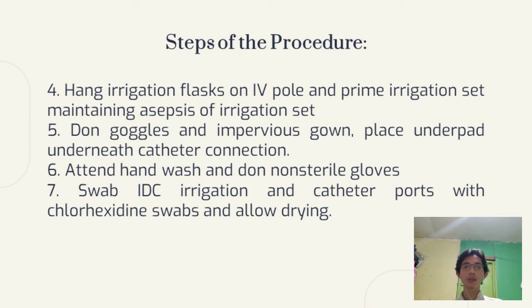So next step is to don goggles and an impervious gown, placed underneath the catheter connection. Next is to attend hand wash and don non-sterile gloves. Next is to swab the indwelling catheter irrigation and catheter ports with chlorhexidine swabs and allow drying.